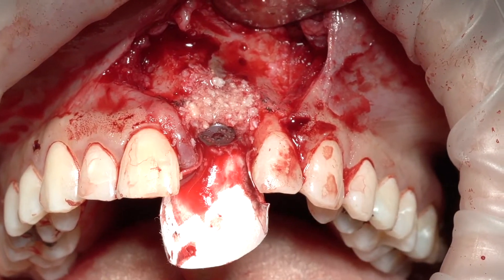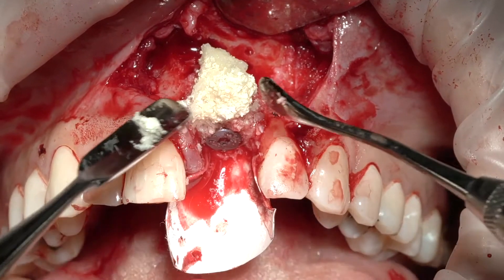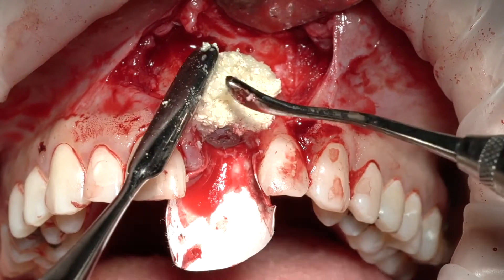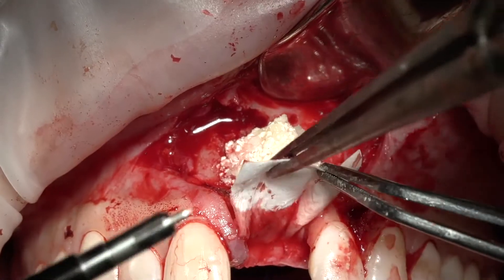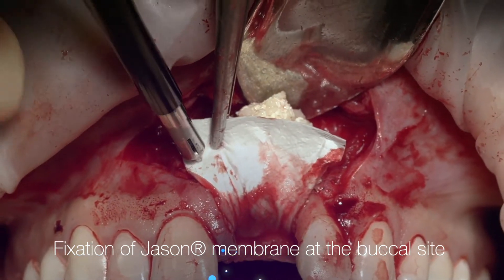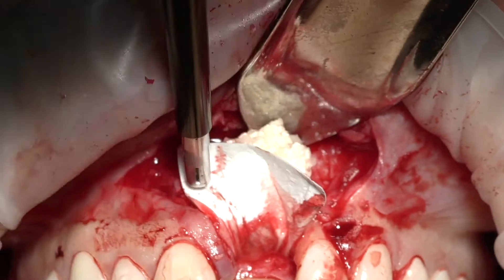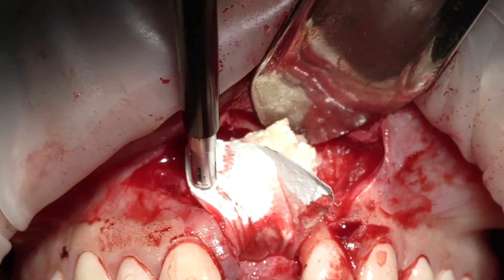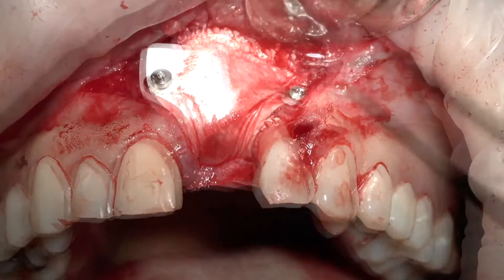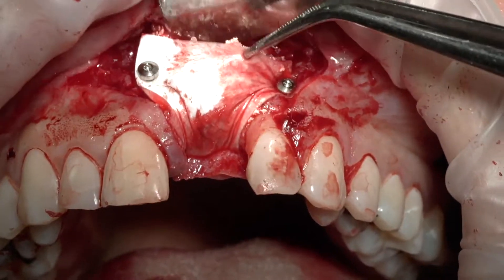My second layer is going to be mainly xenograft, but I'll also mix it with some autogenous to give it the ability to remodel and convert into natural bone. We graft in a way to produce that profile. We put the first layer there, stabilize it, put some pressure, and then when you finish you just twist it to the side. Now this is a chance to push the bone underneath the membrane.